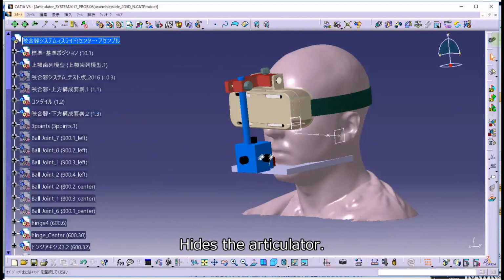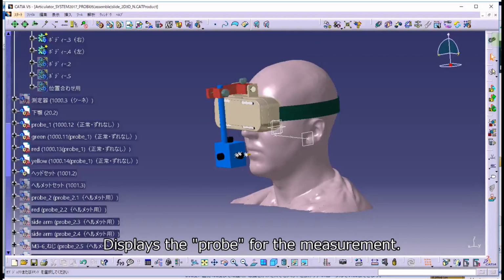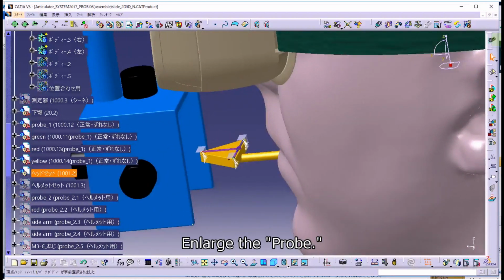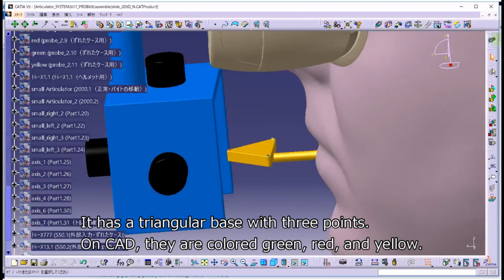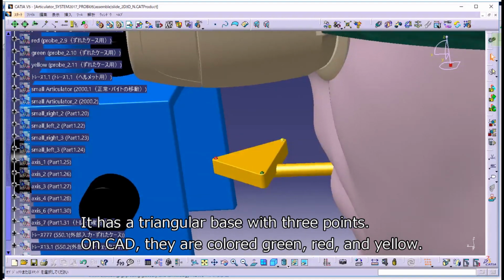Hides the articulator. Displays the probe for the measurement. Enlarge the probe. Hide the ultra-compact articulator from the model tree. It has a triangular base with 3 points. On CAD, they are colored green, red, and yellow.